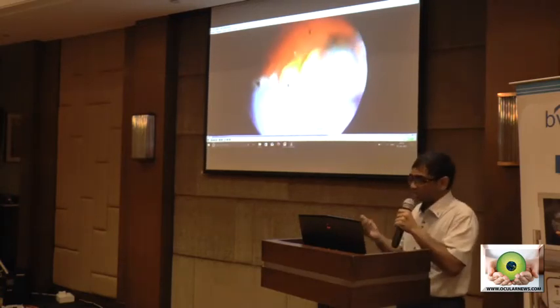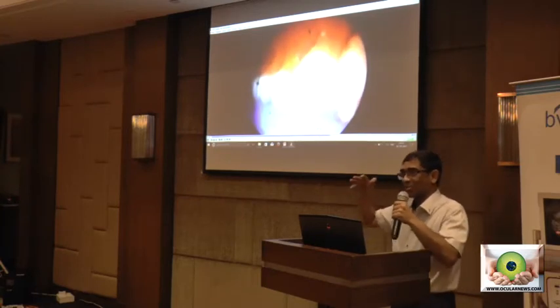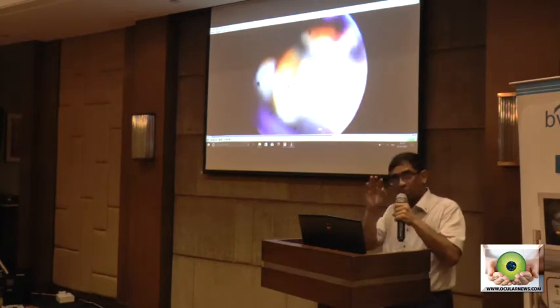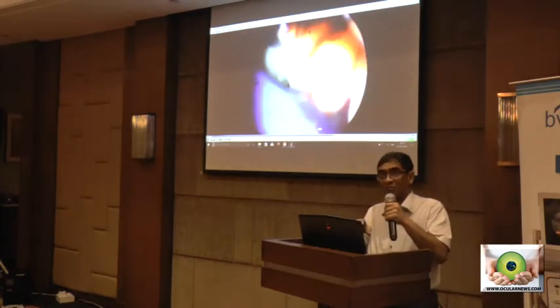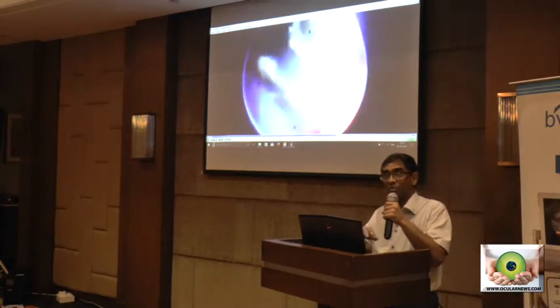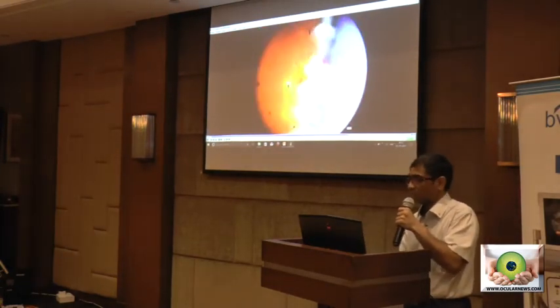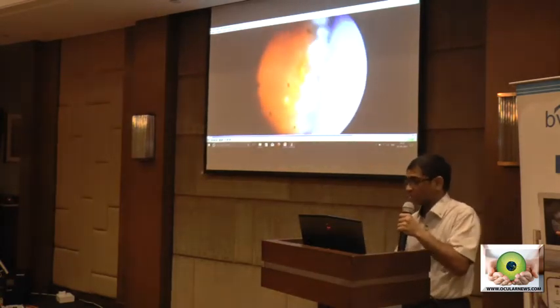Rubeotic glaucomas, people have been talking about it. Initially it's wonderful, and then everything starts going back again. So in rubeotic glaucoma, do the laser, and put in an anti-VEGF or whatever VEGF agent you want, and as soon as the media clears up, which it will, because in this patient whom I did, the very next day the media was clear enough for me to start doing laser. So that's the kind of advantage. You still have to do your PRP. You still want to treat right up to the ora or even beyond.